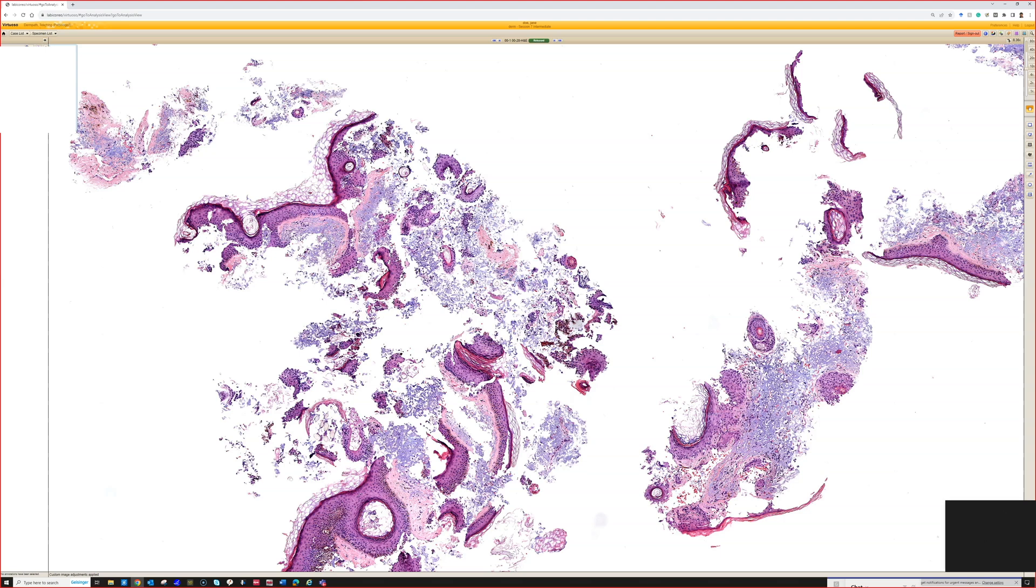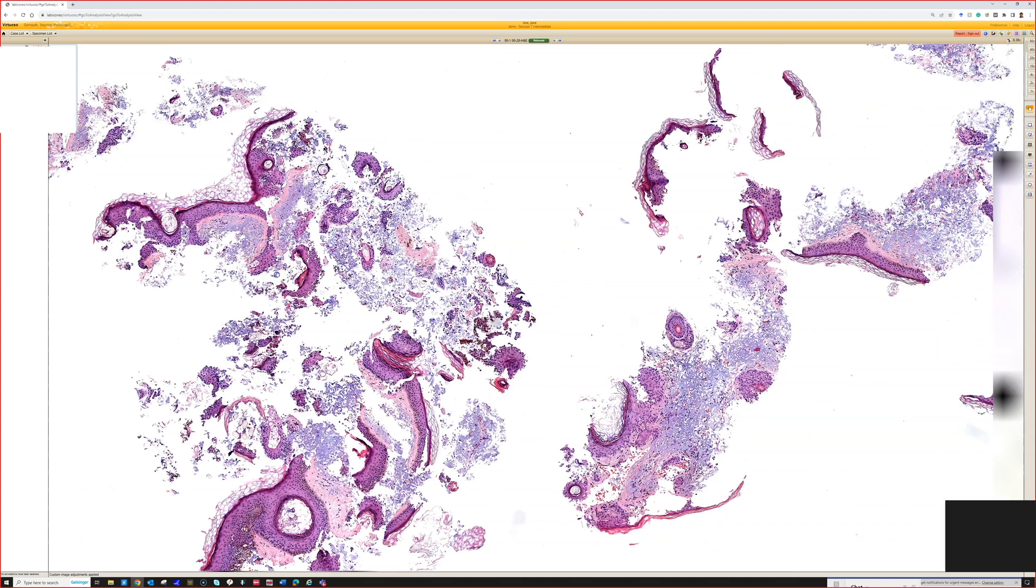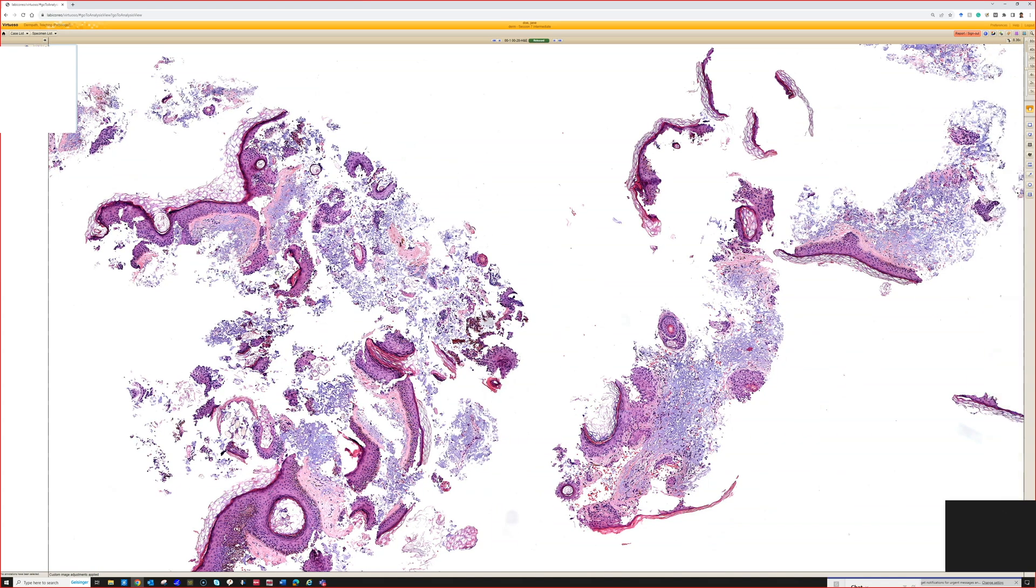And we can measure. All of our derm path is based on that, with the exception maybe of alopecia biopsies. But that's how we measure Breslow thickness. So when you have a really tangential fragmented specimen like this, there's no way to give an accurate Breslow thickness.